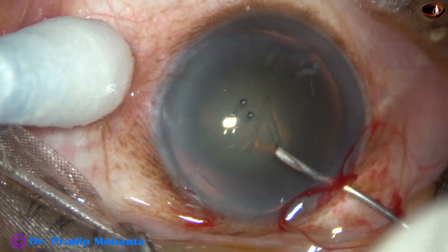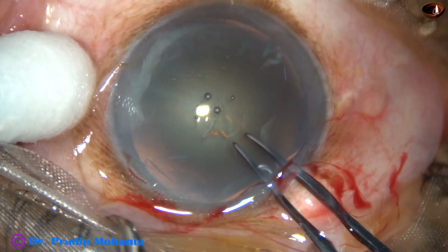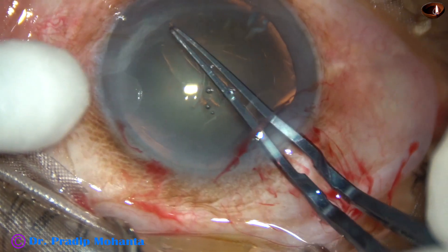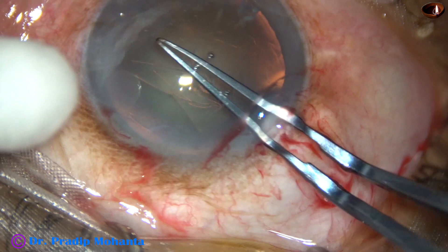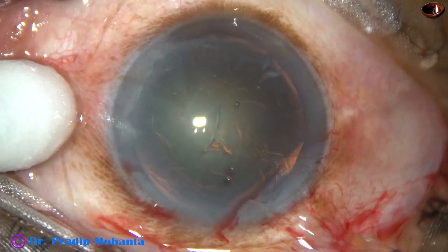A capsular tag has been raised with the help of a 26-gauge bare needle. Then utrata forceps is used to hold this capsular tag. Then I go anticlockwise and do an adequately sized round capsular rhexis.